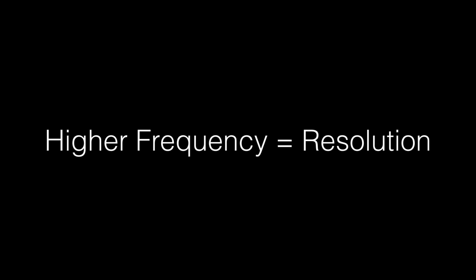Broadband transducers are transducers that can produce multiple different frequencies rather than a single frequency like in older systems. And you can select a different frequency. And because of this, you need to understand that higher frequencies will give you greater resolution, but less penetration.